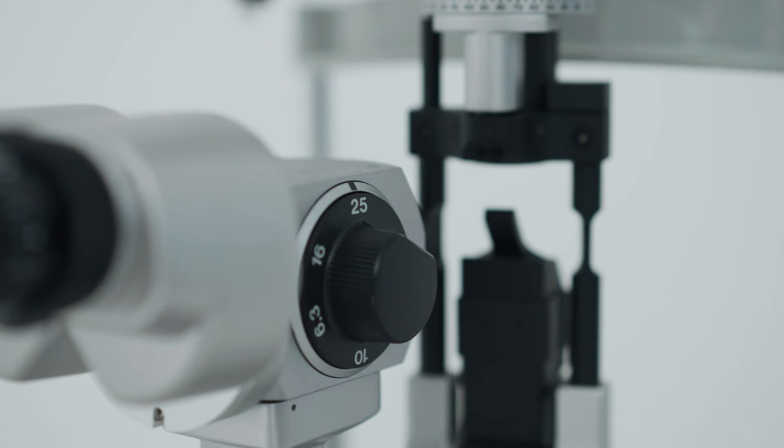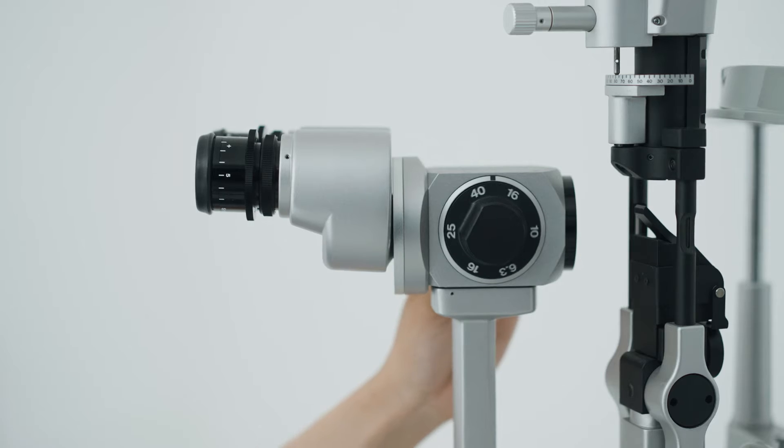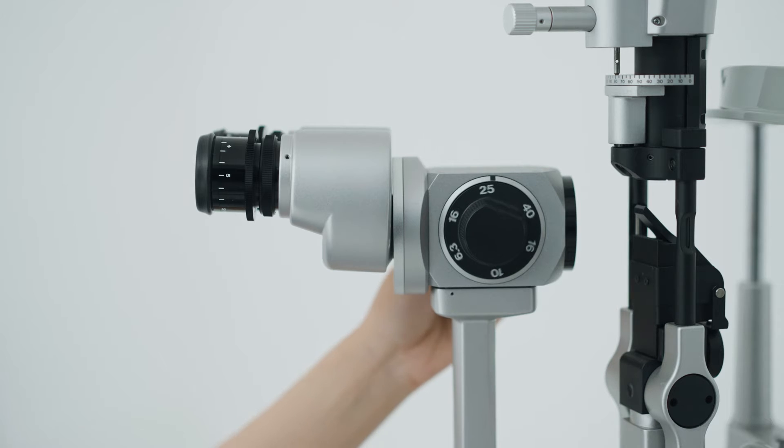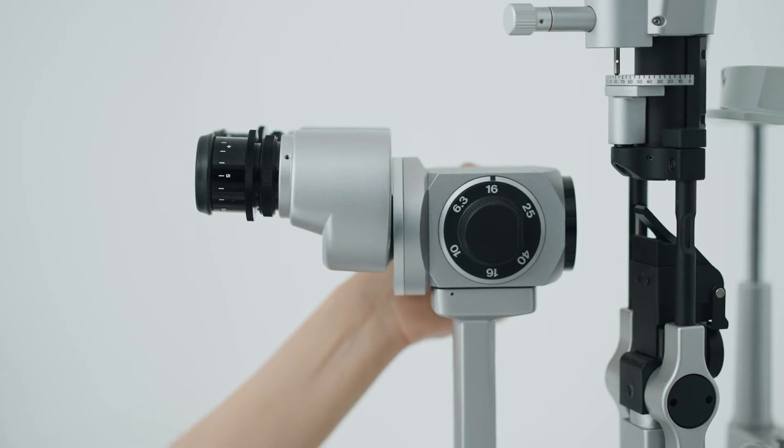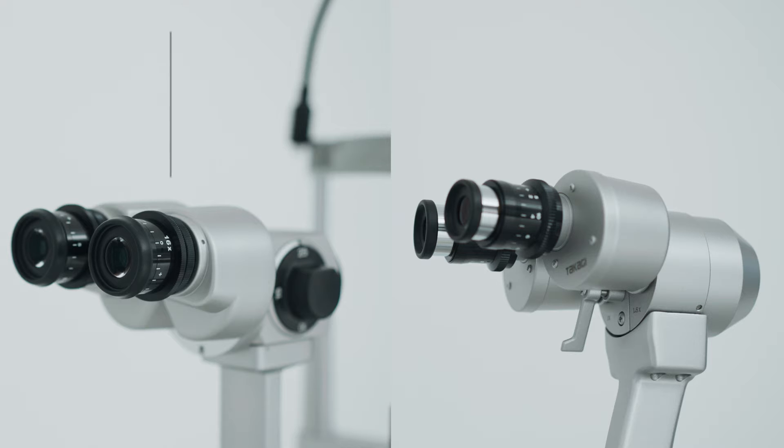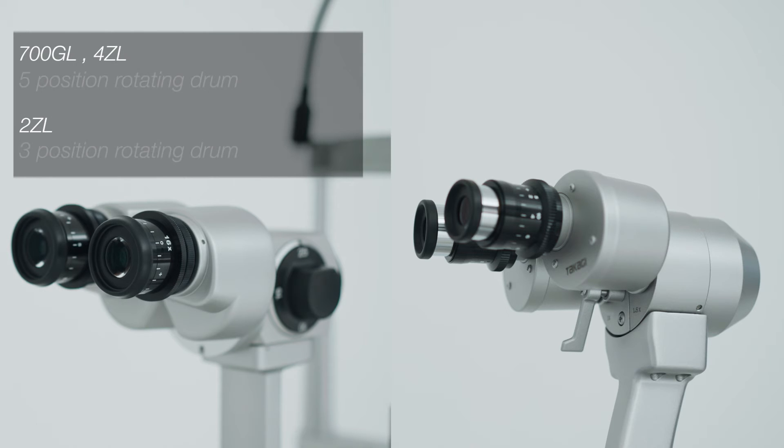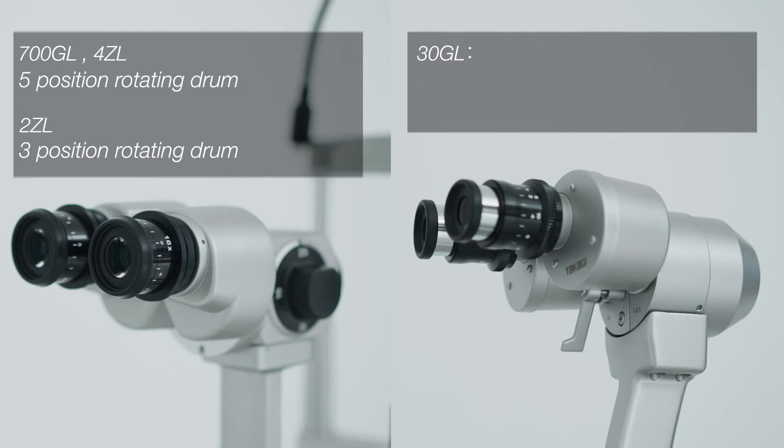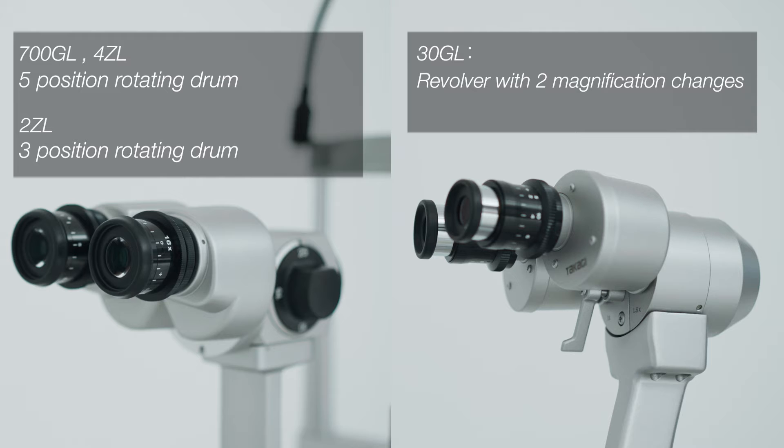700GL and 4ZL are high-end models that offer 5-step magnification and 30GL with 2-step magnification and 2ZL with 3-step magnification provide outstanding cost performance.